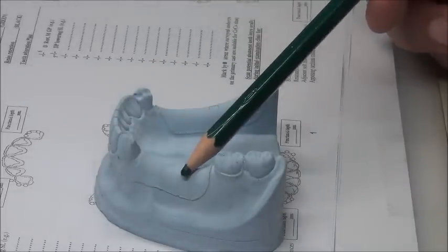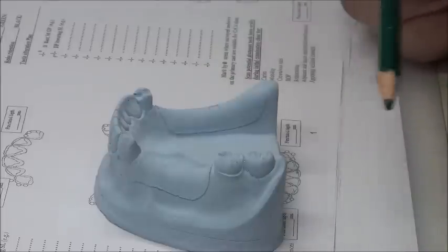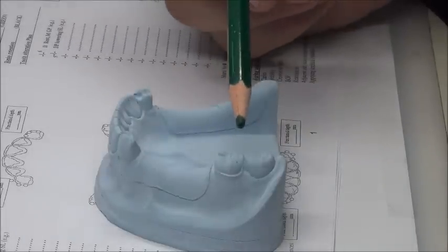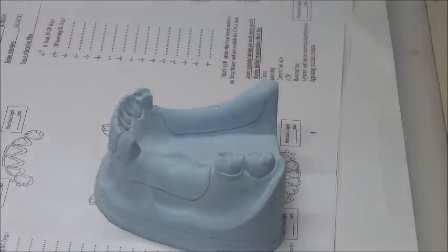But in action, this also happens, and we place a mesh in bounded areas. Bounded areas are okay with mesh, and usually we don't have a lot of resorption. This is the idea about bounded areas. Not a lot of resorption happens. That means we need a place for teeth, and we usually put mesh there. We don't find places to place the teeth in the interocclusal spaces. So this is the design.